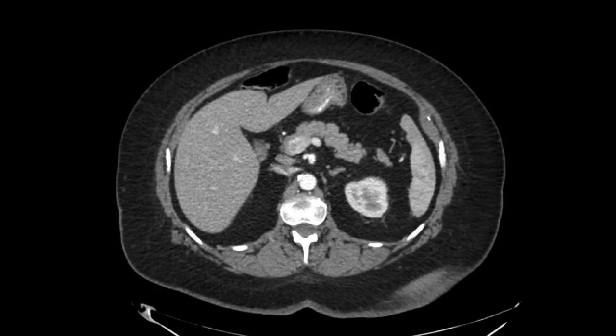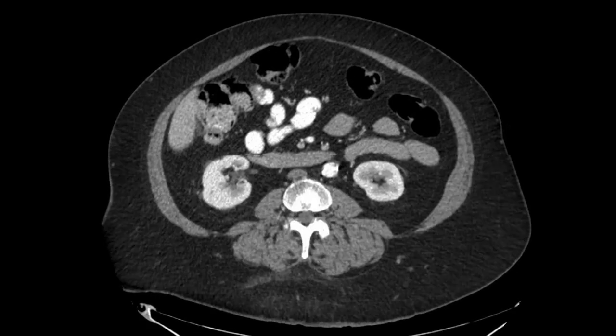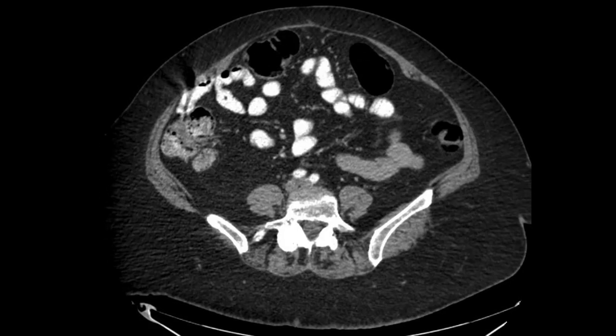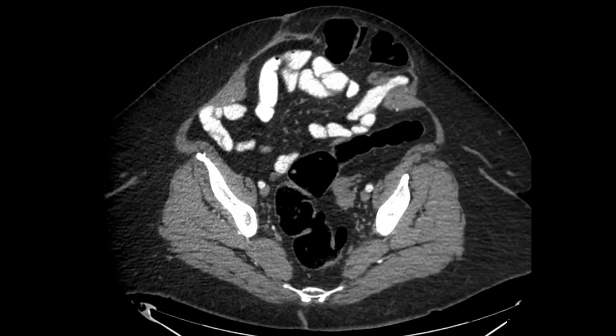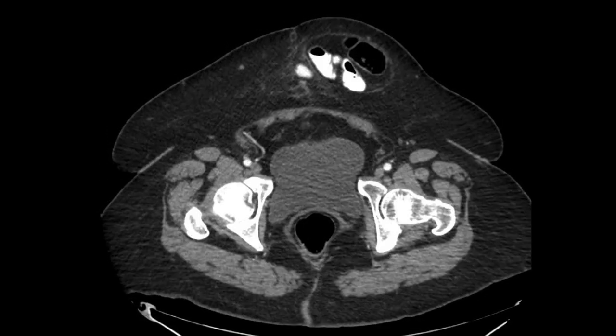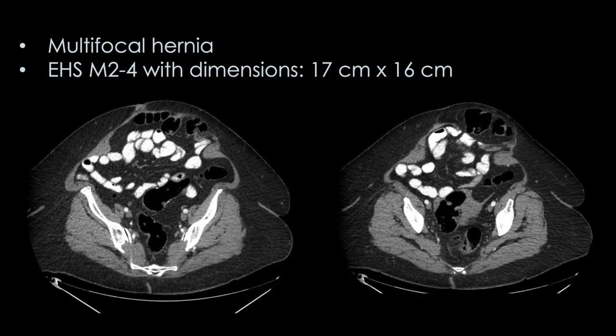Looking at her cross-sectional imaging, the upper abdomen doesn't have much in terms of hernias, but around M2 and M3 we transition to a large 17-centimeter wide hernia. It's a multifocal hernia — hernias within hernias, what I like to call inception hernias — containing colon, small bowel, and omentum. She had evidence of good compliance of the abdominal wall with the saggy lateral sign and the sunken rectus sign.